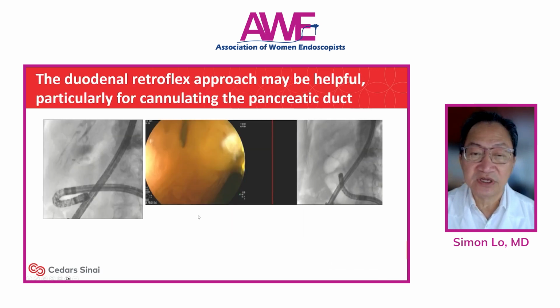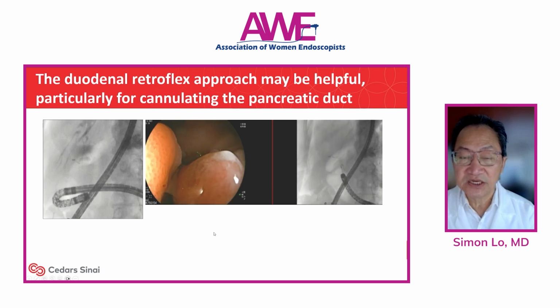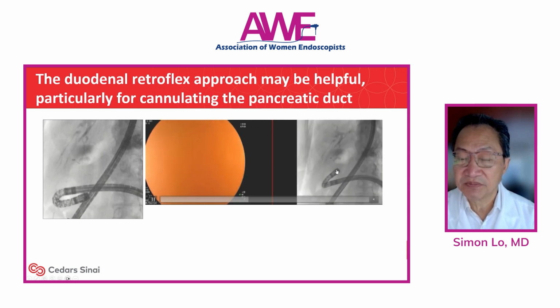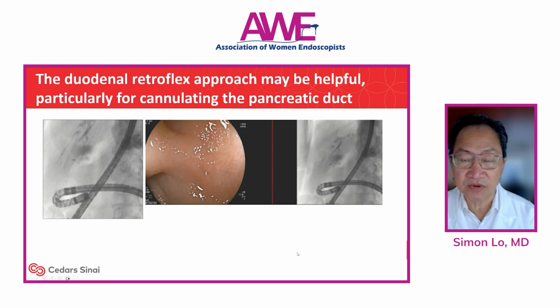On the other hand, if you're dealing with the pancreatic duct, frequently you would need to do a retroflexion within the duodenum, such as in this case. But be careful when you're doing this maneuver not to excessively push your scope, because you can cause perforation that way.